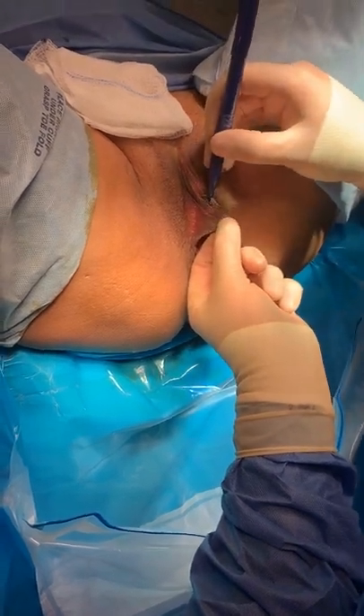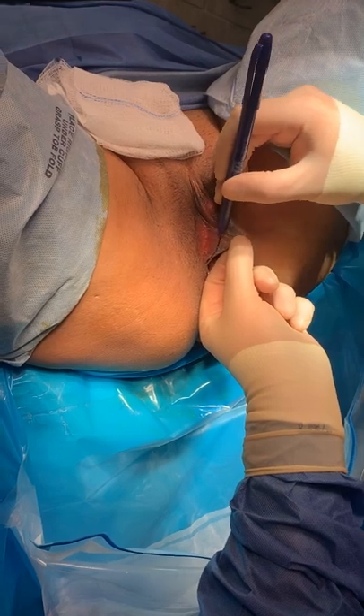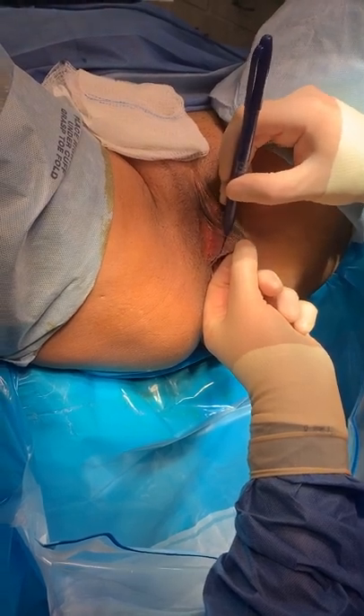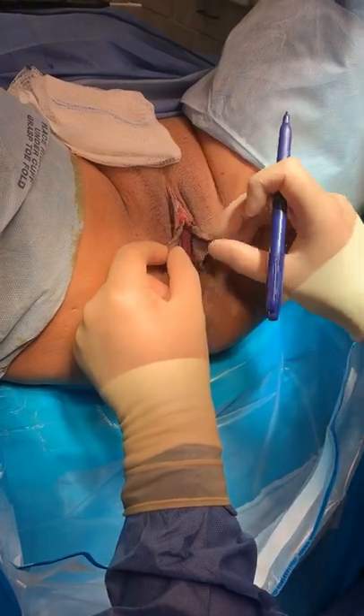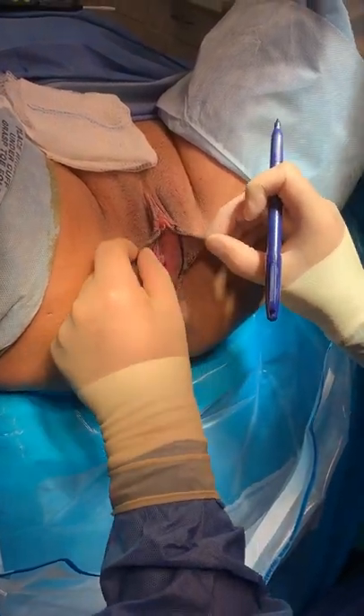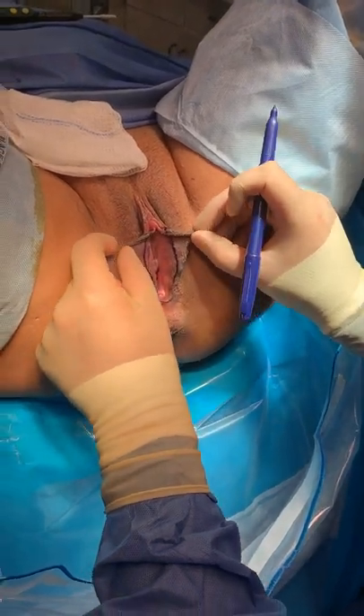On this side, I'm going to follow the same rule — one centimeter above — and I'm just going to gently come. The biggest mistake people make in the beginning is they over-resect because they don't anticipate the amount of retraction that's going to happen when we use heat and during the healing process.